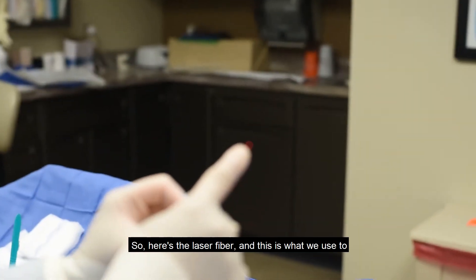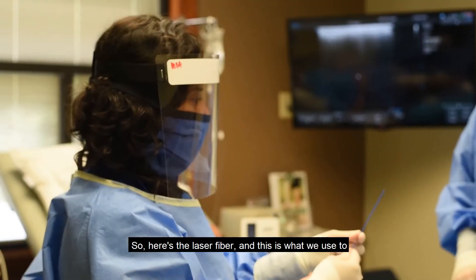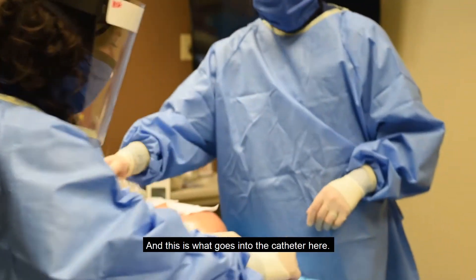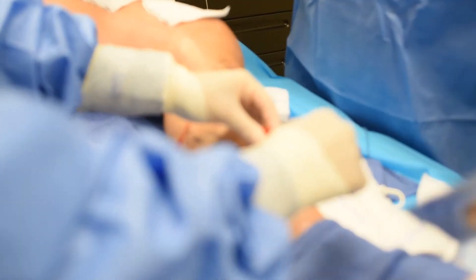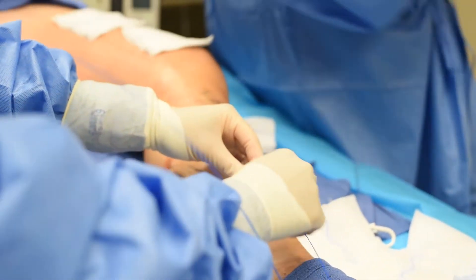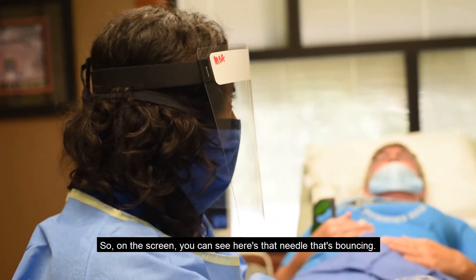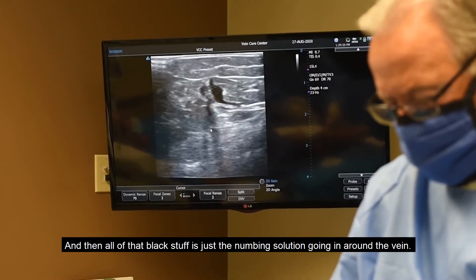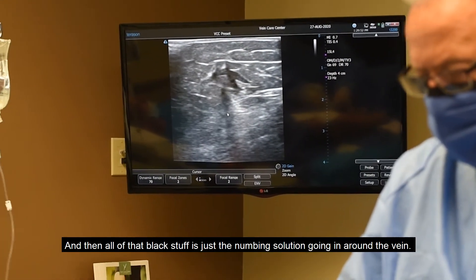Here's the laser fiber, and this is what we use to laser the vein — it shoots out of the top here and goes into the catheter. On the screen, Kyle, you can see there's that needle bouncing, and all that black stuff is just the numbing solution going in around the vein.